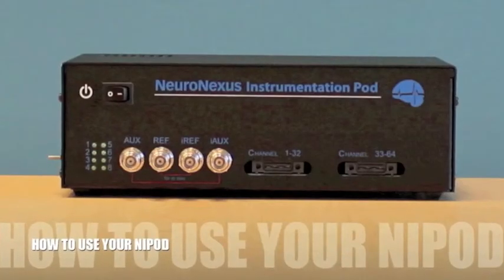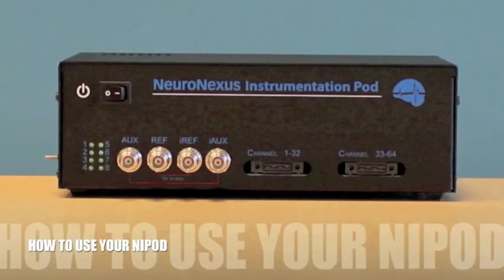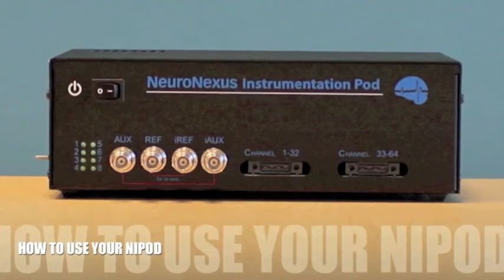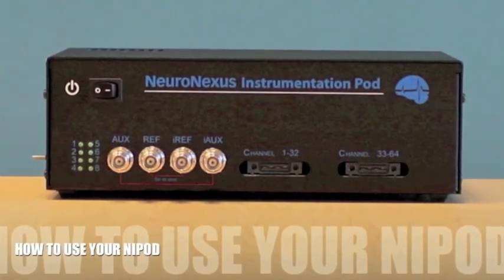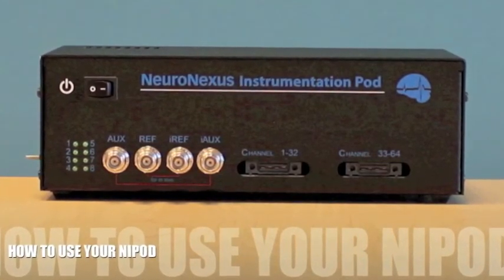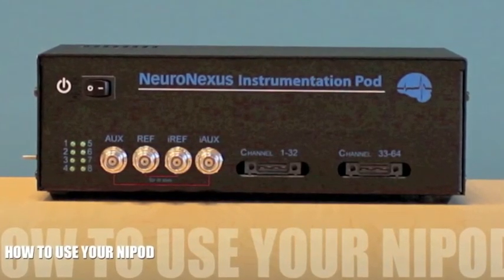This is the basic operation for impedance measurements. Other features will utilize similar operations and you can see other videos for how to do those.